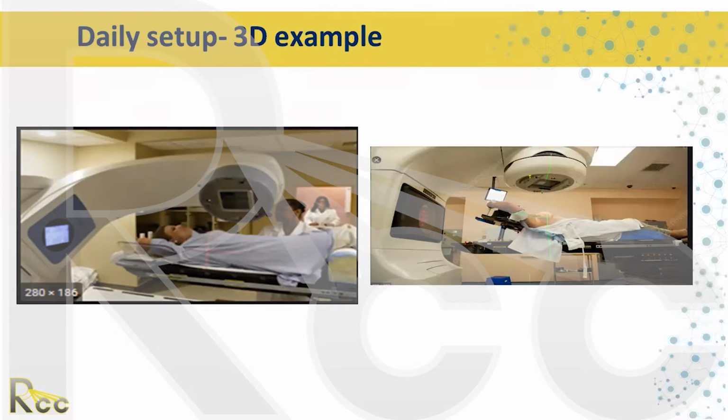So once you get the patient aligned and you perform your shifts, you're gonna visually move the gantry to the medial tangent and check to see where the edge of the field is intersecting and make sure that matches the plan. And also you wanna make sure that there's no skin folds. You wanna make sure that the flash is correct, that their chin is turned away from the field if you're doing a superclav, and just make sure everything looks safe and ready to leave the room.